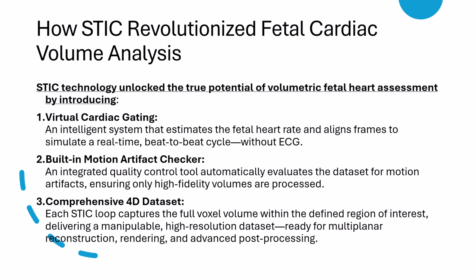Finally, each STIC loop captures a comprehensive 4D dataset. This loop includes all the voxel information within the region of interest, providing us with a high-resolution manipulable dataset. This means that once the dataset is acquired, it is ready for multiplanar reconstruction, advanced rendering, and post-processing, giving us the flexibility to examine the fetal heart from multiple angles and perspectives.